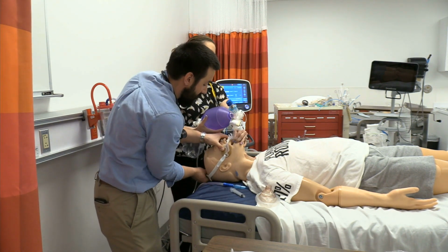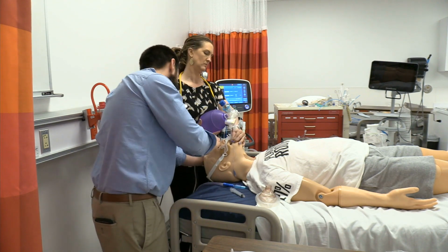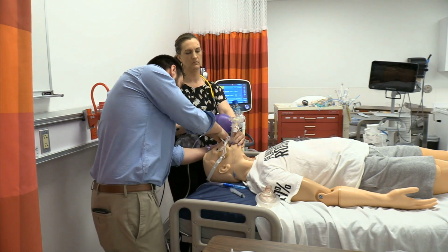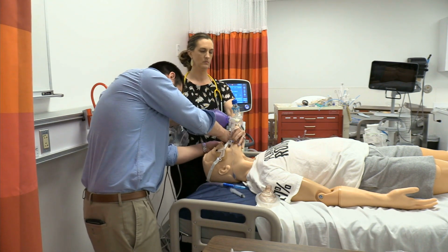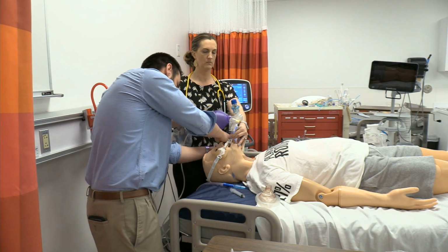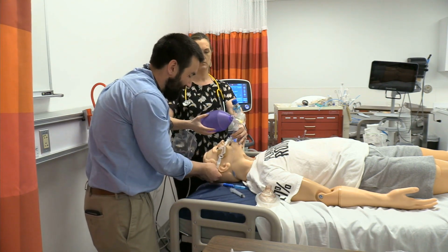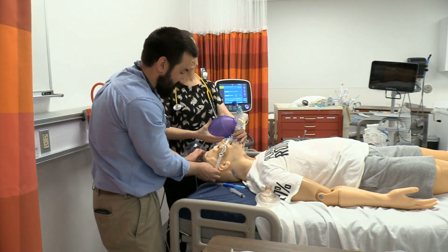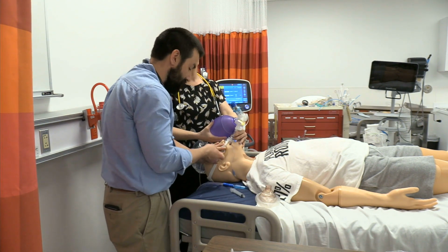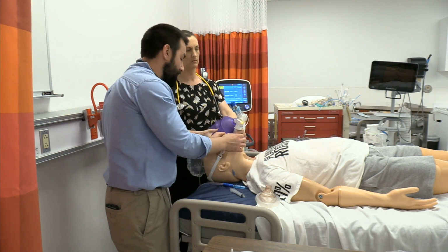Usually at this point you could go ahead and secure the tube. Since we're not using an adhesive, I'm going to go ahead and secure these straps. I like to be able to go up over the crown of the head and above the ears, but depending on how somebody's face is shaped and how everything sets up, sometimes that's not feasible. You just want to make sure you're not causing any sort of tissue breakdown or rubbing anything or folding the ear over or anything like that. The strap is really just a fail-safe in case the adhesive fails.